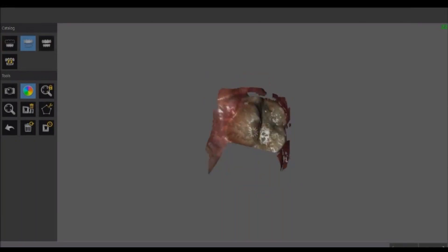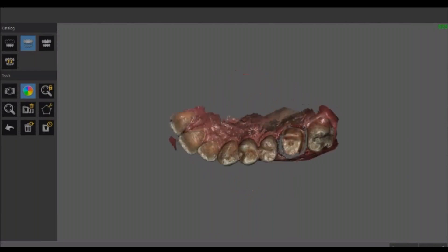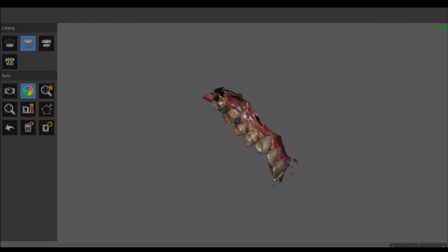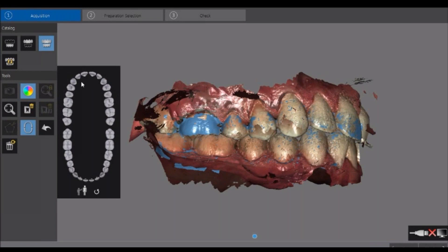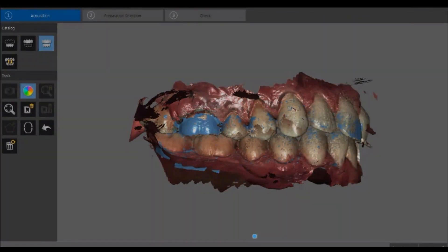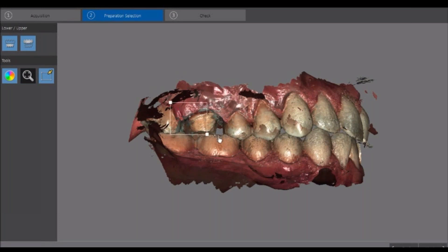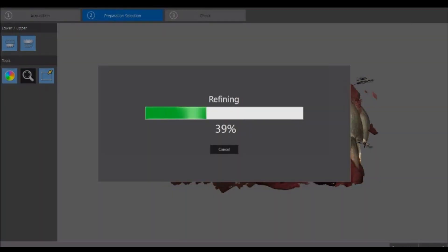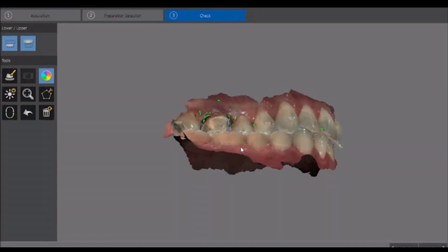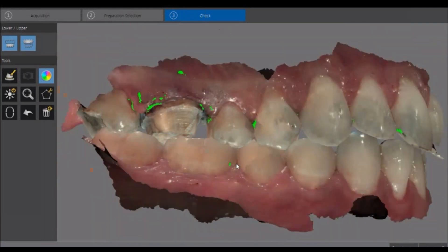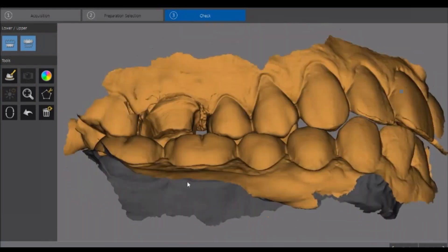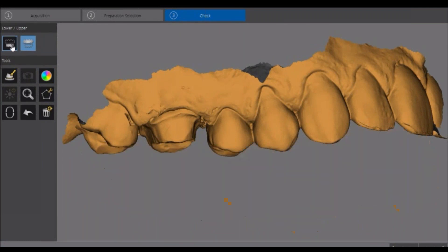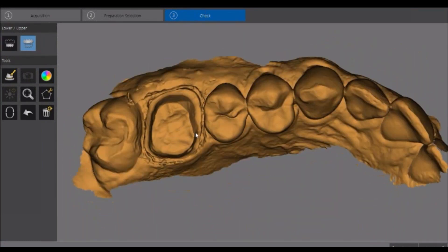Here's a scan showing the workflow for doing a single-tooth crown on a natural tooth. We're scanning the upper arch, lower arch, and scanning in the bite. There's a selection process for refinement so the software does extra refinement on the prep tooth area. This video is sped up, but it just takes a few minutes in the operatory. We're able to look at the margins, and our assistants are doing 90% of the scanning in our practice, which has freed up the doctors.